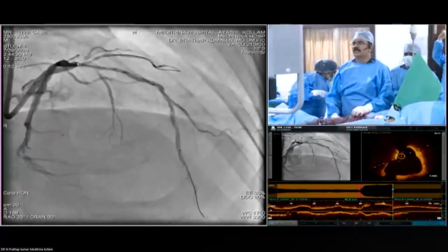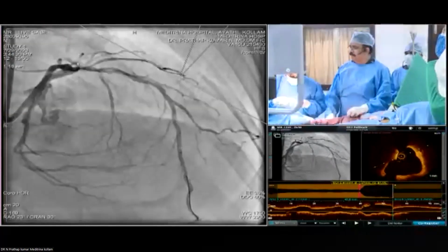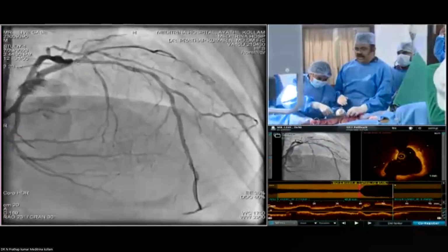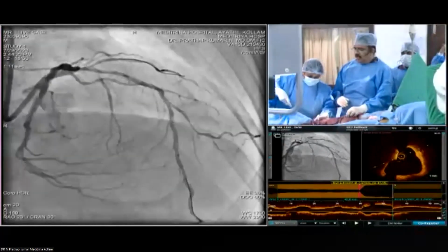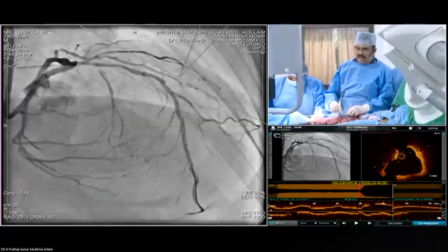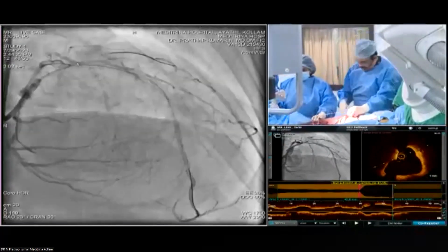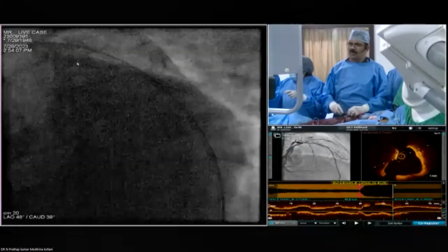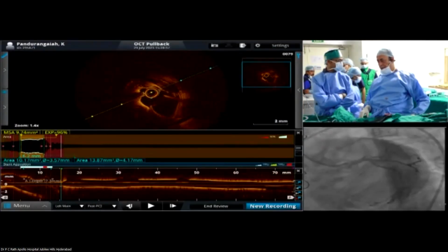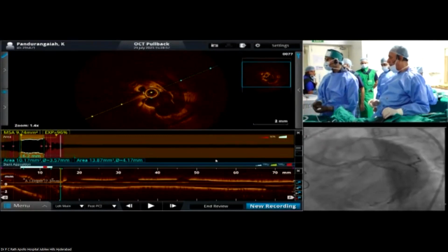So many people used to do this in the USA. In Asia, more than 90% of cases, they do mini crush, even for that type of lesion, and the result is very acceptable. Sir, we can try with DK crush, because DK crush has multiple steps here, but I think there is time up to 4 o'clock. I personally feel that Dr. Chandra and Dr. Rath will allow me to show the steps properly. Yes, and we would like to go back to Dr. Kumar.